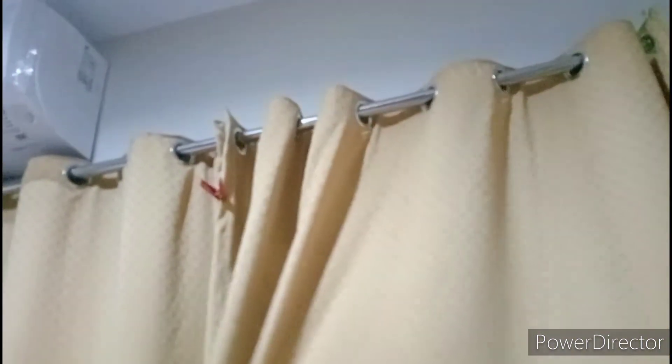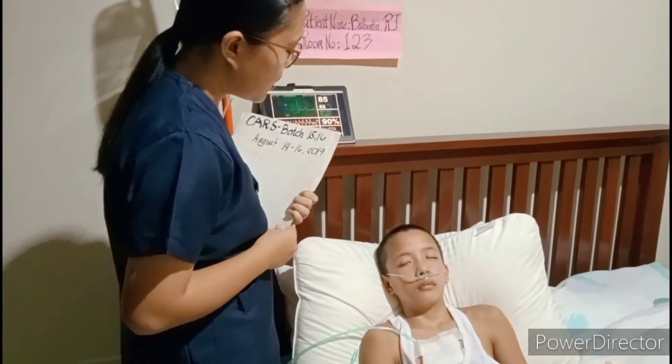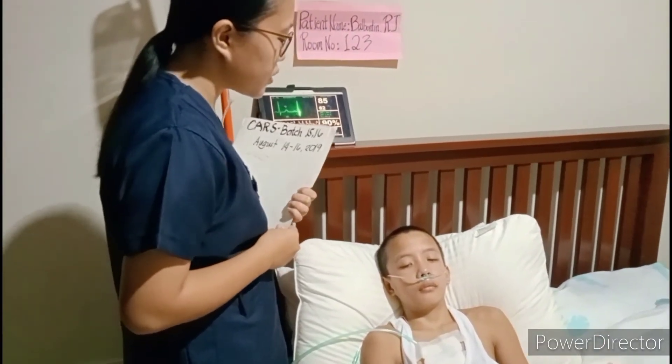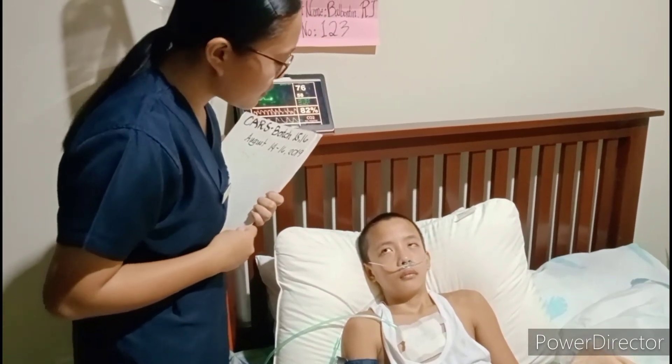Next is to provide patient privacy. Then explain the procedure to the patient. Good morning sir, I'm student nurse Abidjun Balbantin, and today we will be checking your central venous line.